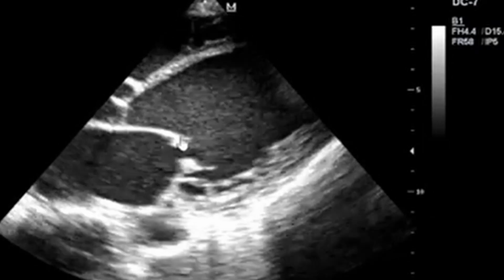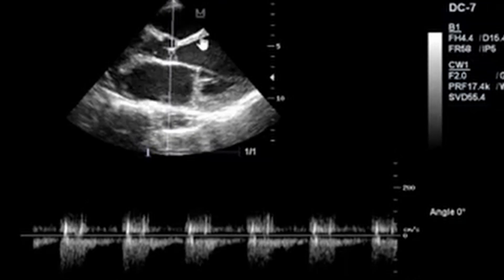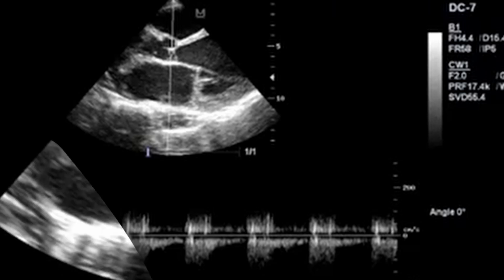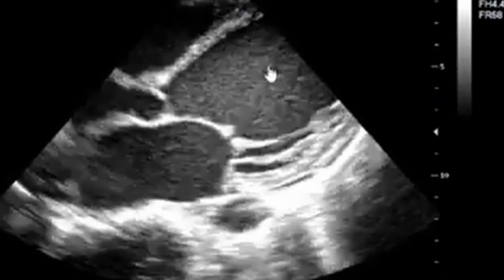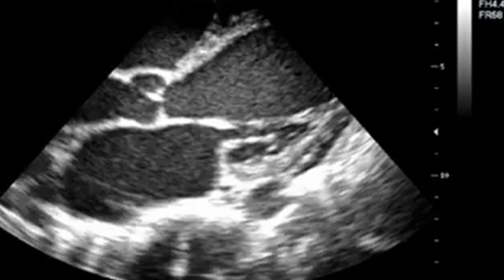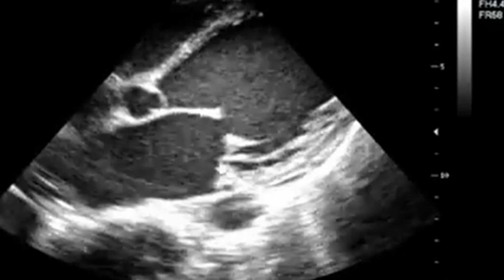The mitral valve is calcified. Here is an assessment of the aortic valve, and you can appreciate that there is regurgitation taking place in both the mitral valve and the aortic valve — backflow of blood is also taking place there.